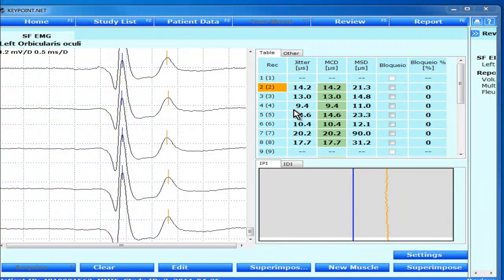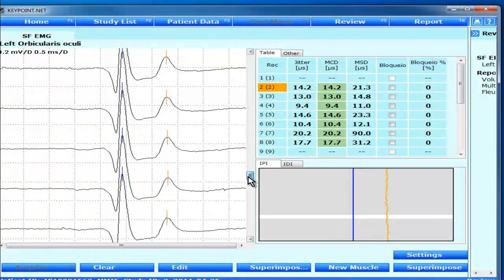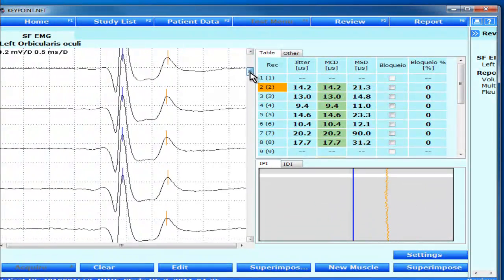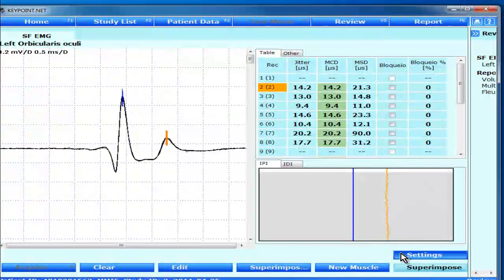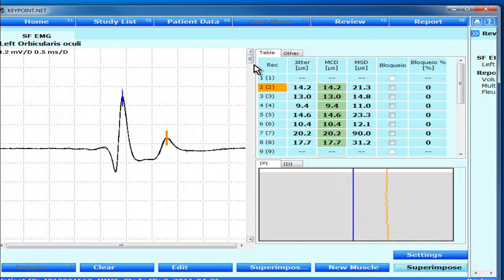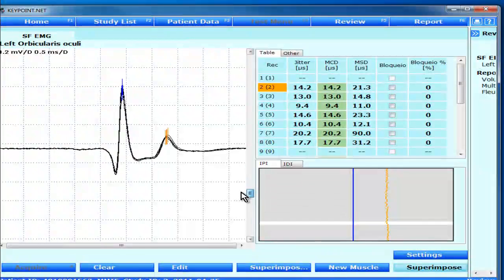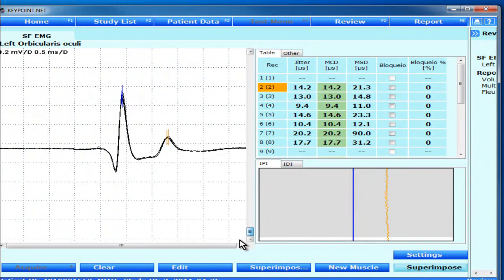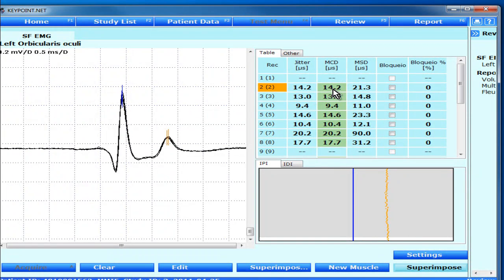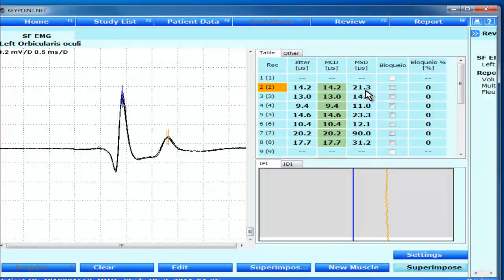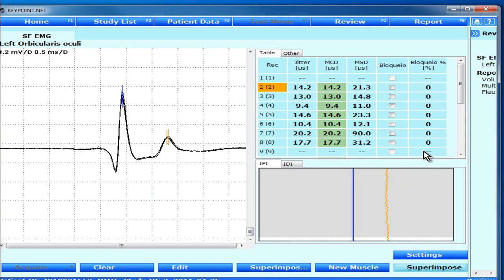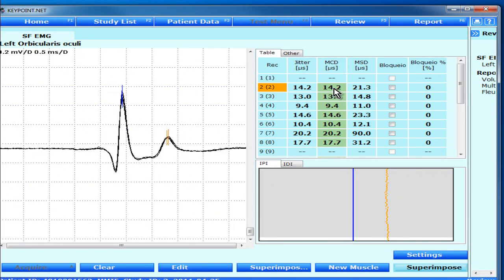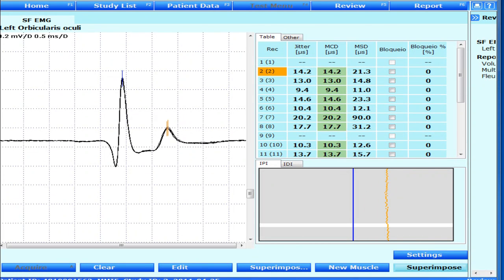Here is a situation during voluntary contraction with nice recordings like this, and superimposed it looks like this, and one can see that the jitter is very small. But the only thing is that the MCD is 14.2 and the MSD is 21—larger—and that is usually indicating trends but enough to give a larger MSD than the MCD.